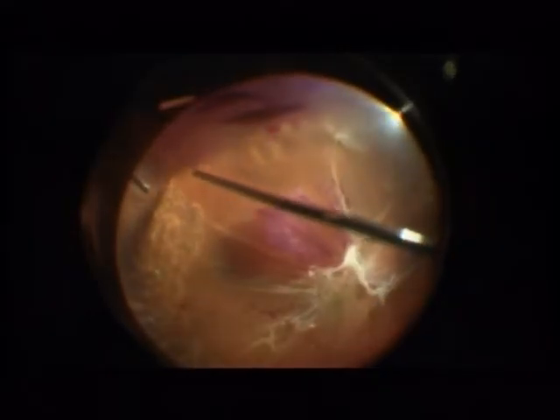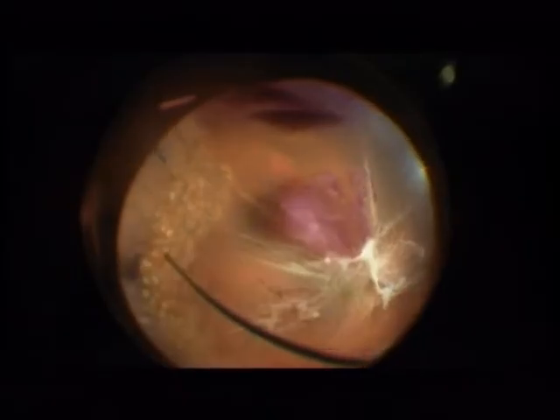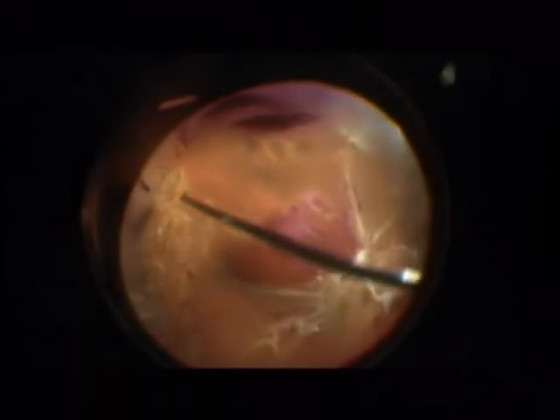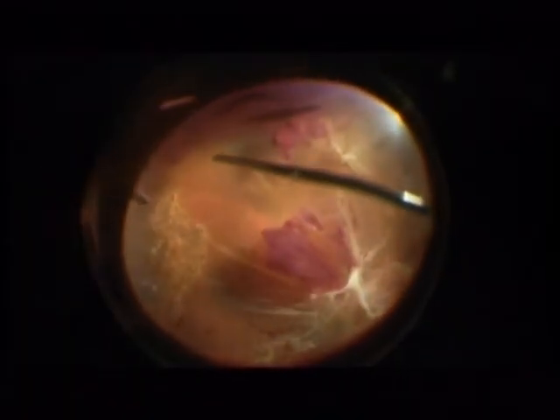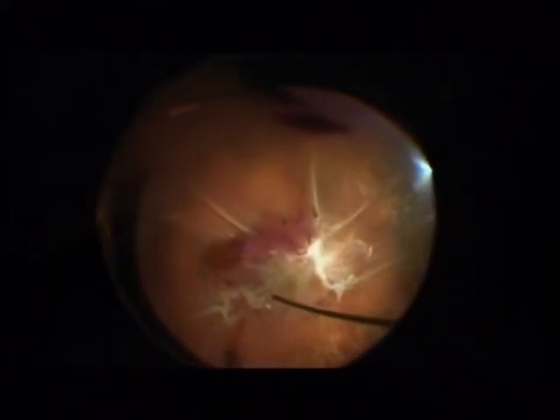Usually the posterior hyaloid is attached at the central pole and detached in the periphery. It may be possible that the posterior hyaloid is even attached at the nasal pole in the periphery. The aim is to open up the posterior hyaloid in the periphery as much as possible.